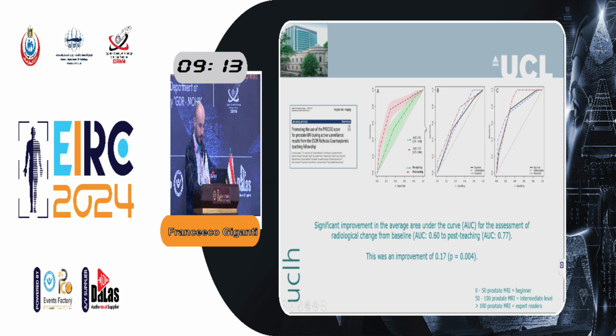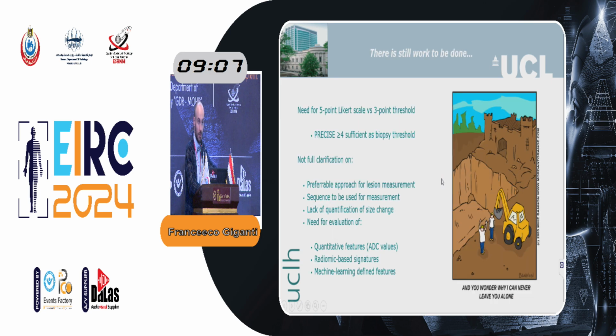As we have seen for PI-QUAL, also for PRECISE, we can teach how to use PRECISE, and here you can see the difference of the area under the curve for different levels of expertise, and there has been an improvement before and after a course. But there is still work to be done.